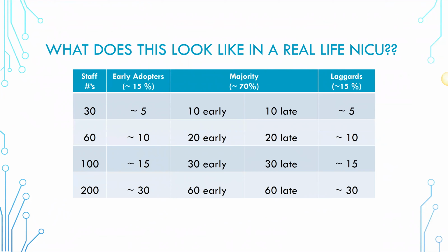So whether that means they're responding to treatment, so if we're giving anti-epileptics, or whether or not we're seeing normalization of pattern. So for example, for a baby who's undergoing cooling, do we see improvement in their tracing? And I did a full other webinar on how to read aEEG, so I'm not going to spend too much time in this particular talk going over how to read the patterns, although I'll show a couple.